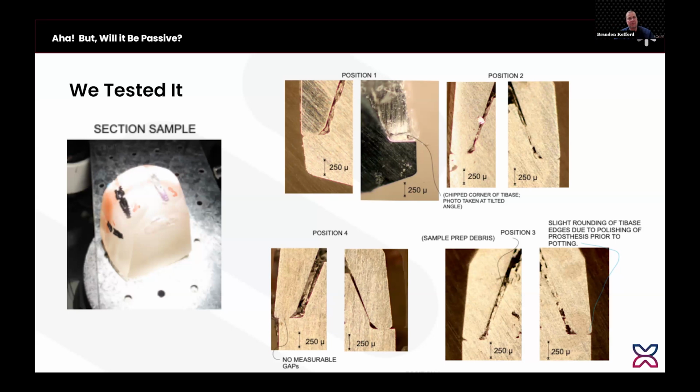Then I randomly placed the abutments back in implants, just trying to make sure that there was no way that I could get those abutments to the same implants that they came out of, right? So different abutments in different implant positions, and then use the prosthesis to reorient it.